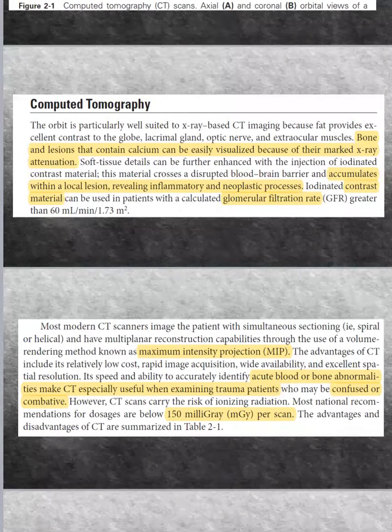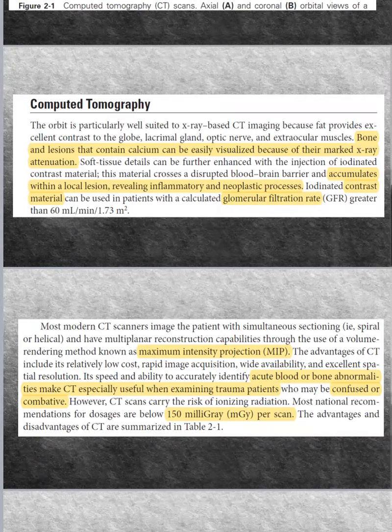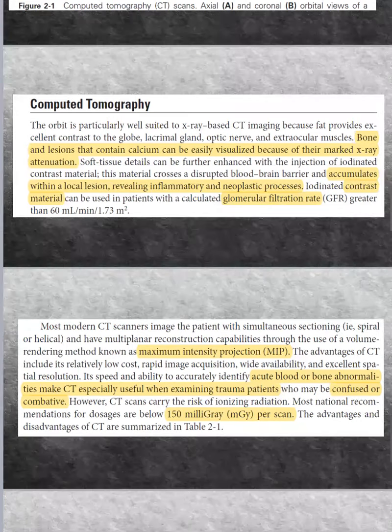Here we may demonstrate bone and calcifications well. This is extremely important. If I have a lesion containing calcium or a bone defect, this will be demonstrated well with CT. So it is important to do urgent CT in cases of trauma or in combative confused people. Combative, I guess you know the meaning of this word.